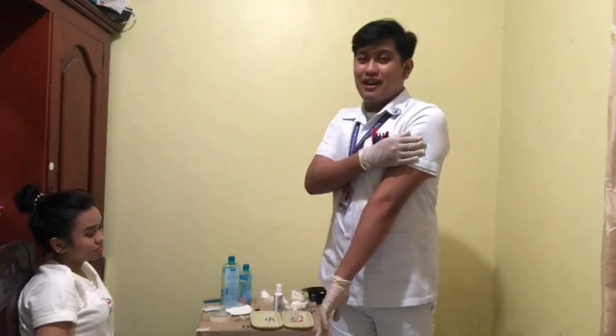In this video, I will be performing a return demonstration on parenteral medication administration. There are 3 sites to which we will be administering medication. These are the intradermal, the intramuscular, and the subcutaneous.